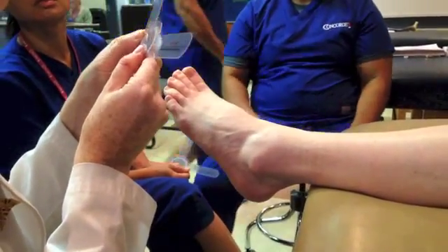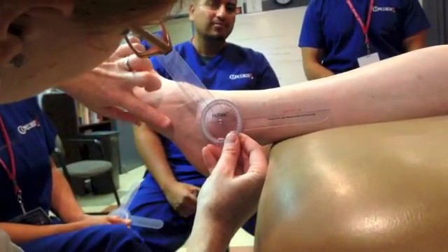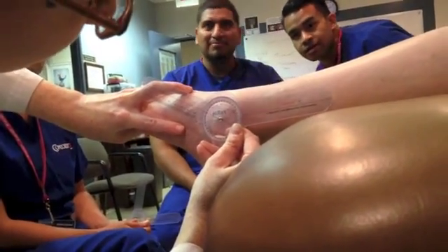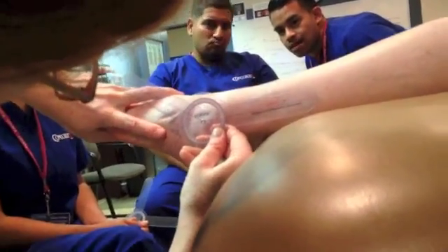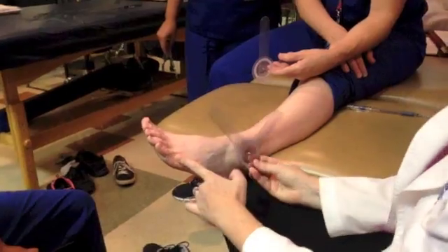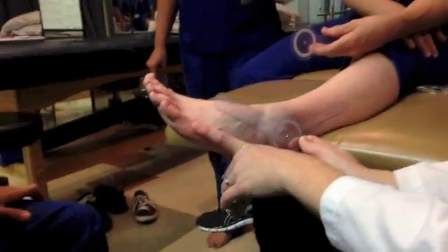I'm going to preset it at 35. There's my fulcrum, there's my stationary arm. Let's find my fifth metatarsal and line it up. I need to make that parallel. So it's actually a little more than we thought — we're closer to about 50. I can line it up parallel to the fifth metatarsal. So this is her resting position.